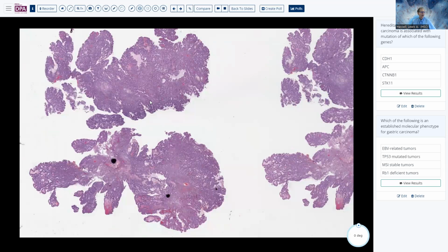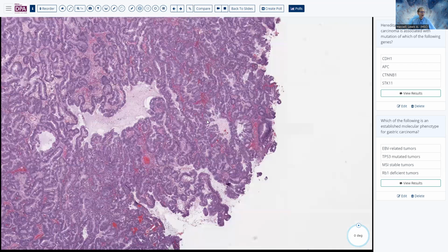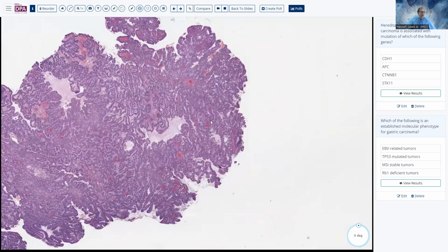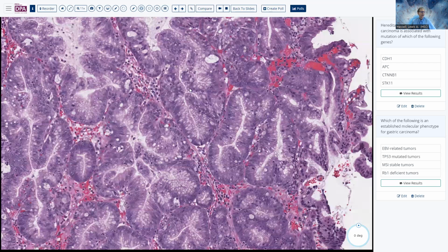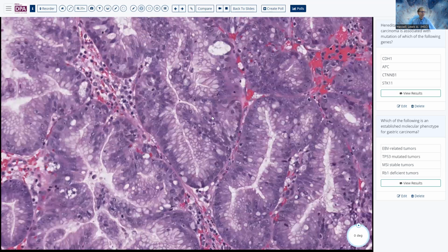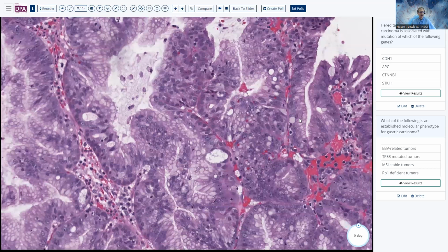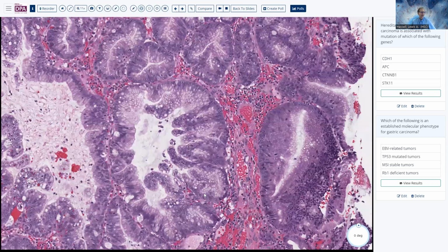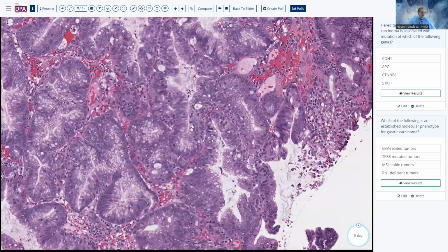Okay, well, let's move on in the stomach to polyps. And of course, a variety of polyps can occur in the stomach. Just at low magnification, this looks like a very hyperplastic polyp with probably mostly foveolar cells, which we can see here have a fairly abundant mucinous cytoplasm. But we're also seeing a few cleared out cells, almost not goblet cells per se, but maybe some are goblet cells. So there can be dysplasia, there can be intestinal metaplasia that can occur in these foveolar adenomas or hyperplastic polyps, as they're often called.